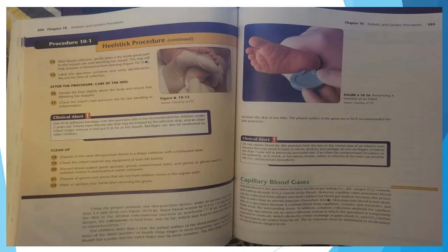Clinical alert. Do not obtain blood by skin puncture from the toes or the central area of an infant's heel because this may result in injury to nerves, tendons, and cartilage. Do not use fingers of infants less than 1 year of age or previously punctured sites. If an infant has compromised circulation to the extremity, as in shock, or has edema, bruises, rashes, or infection at the heel, use another site, such as a venipuncture procedure.